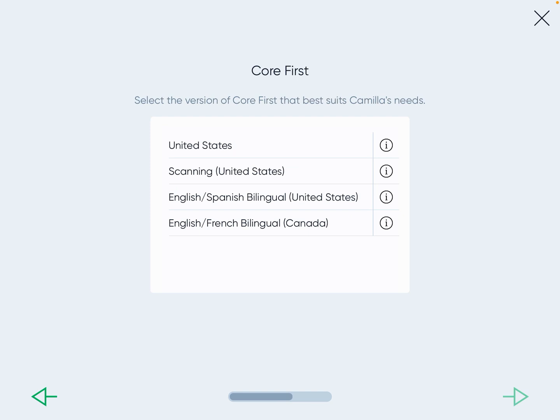Here's the important piece: United States just means it's English only. Scanning is an access method where the system scans through and uses separate buttons to access words and choose. Then you have English-Spanish bilingual and English-French bilingual — this is Canadian French. I haven't used the Canadian French one yet, but I have used the English-Spanish bilingual.